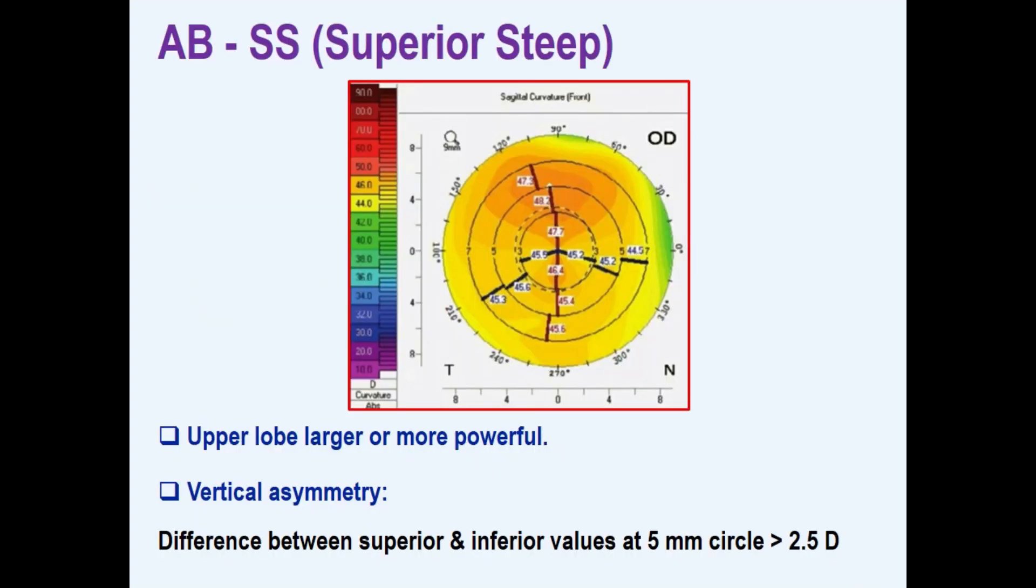Asymmetric bowtie superior steep. In this pattern, the superior loop of the bowtie is larger and more powerful than the inferior loop. If the difference between the average superior and average inferior values at the middle ring is greater than 2.5 diopters, it is abnormal.